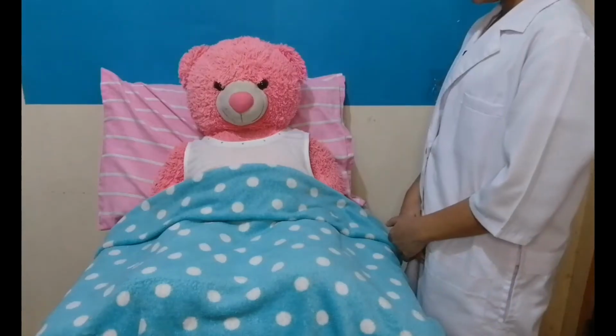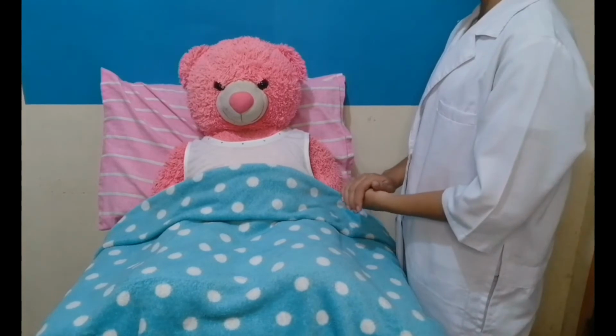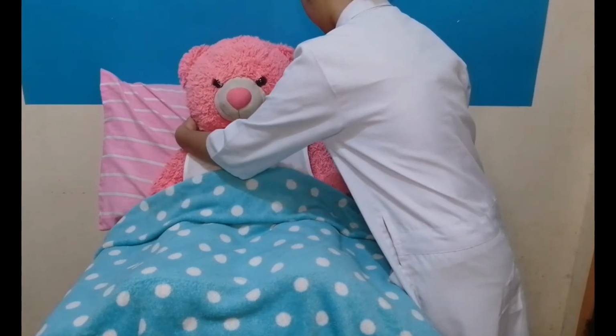Next procedure is to place the client in a supine position with the feet apart and drape the client. Good visualization of the meatus is important. Embarrassment, chilliness, and tension interfere with the introduction of the catheter. Excuse me sir, I am going to assist you into a supine position. Is it okay with you, sir? Okay. Relax lang po, sir.